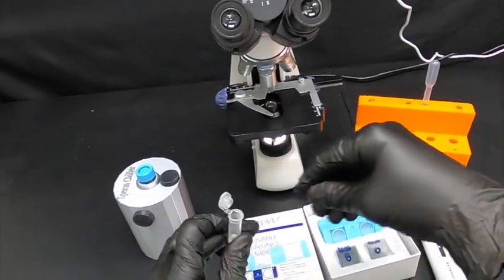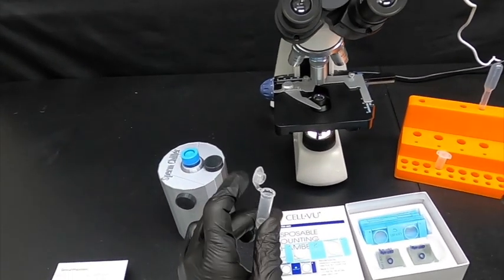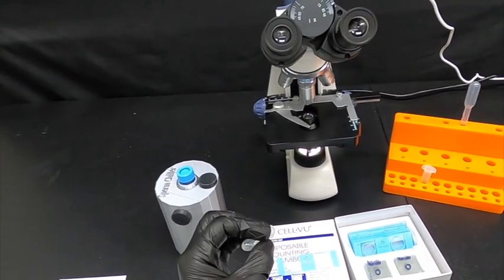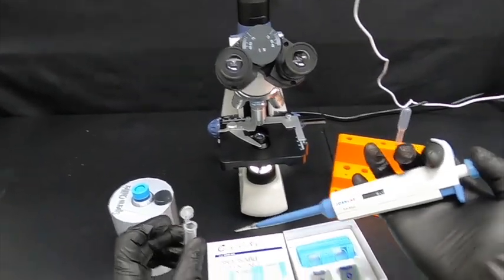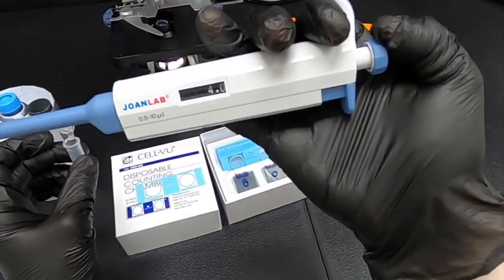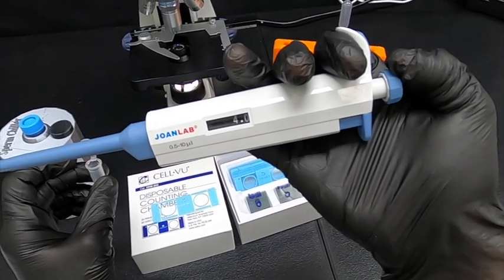So as indicated in the instructions, we'll first mix it by gentle inversion or by brief vortexing and set our mechanical pipette to four microliters.